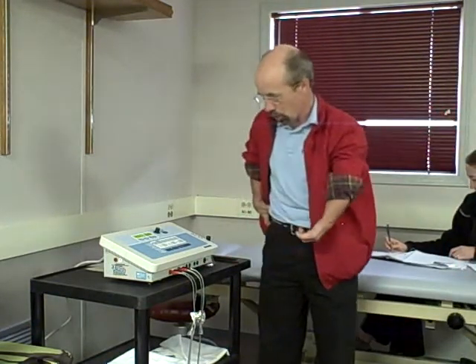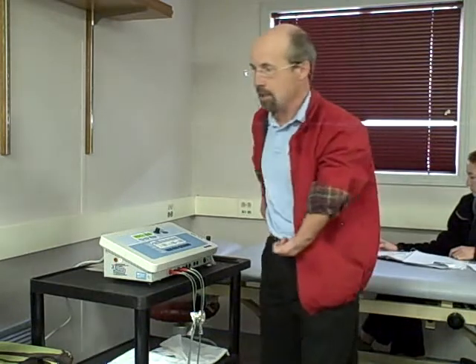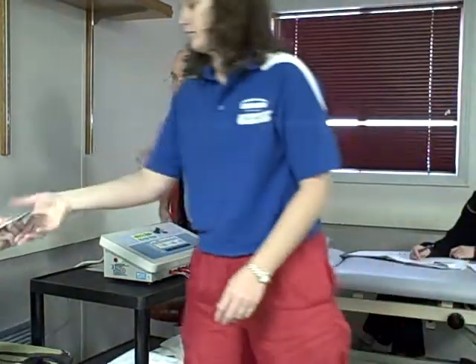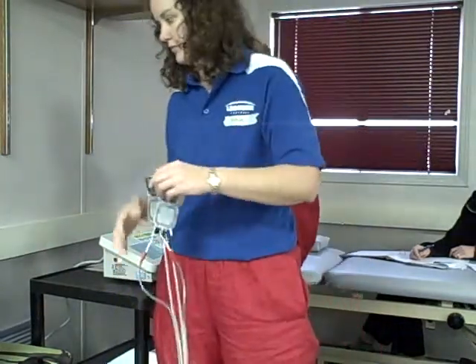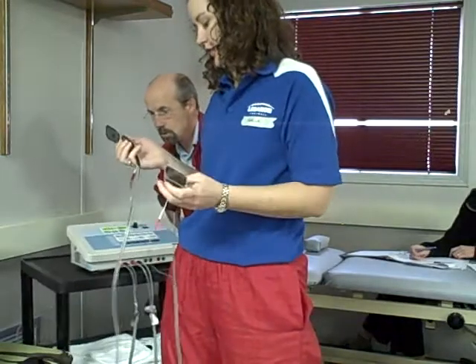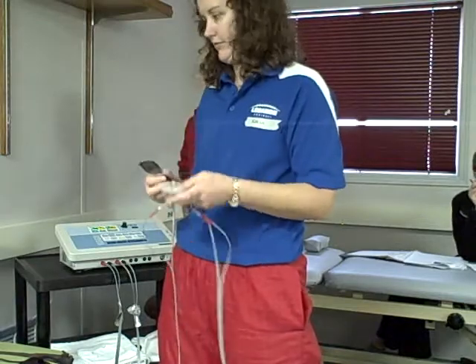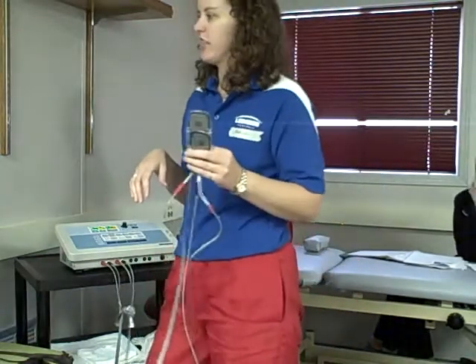Which will be the next waveform, which says pre-mod IFC, which is an imitation IFC, or interferential IFC, which we'll talk about in a second. So Damien is going to set up, and let's have somebody else set him up with quadpolar interferential. You guys decide if you want him to. If you want an arm, or if he's comfortable taking his shirt off, that's up to him. Doesn't matter to me. I can do it arm, shoulder, or back. Taking the shirt off would probably be better if he's comfortable with that, just because you can get a bigger visual, say on his back.